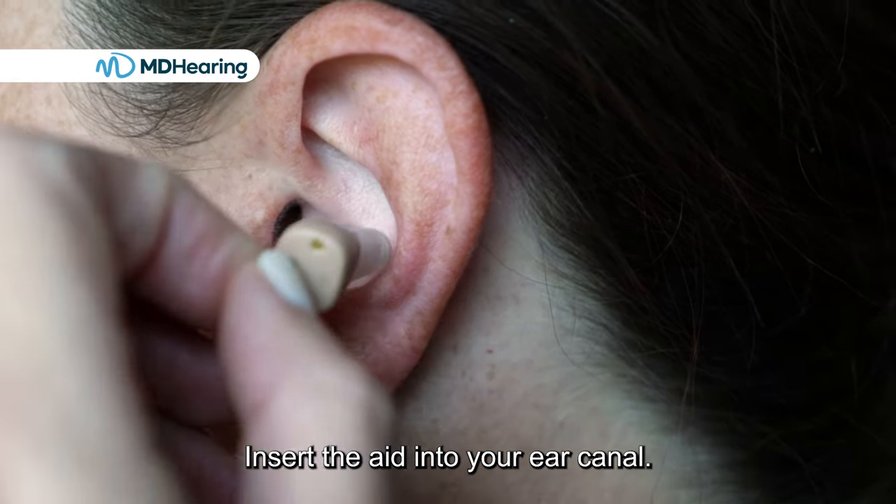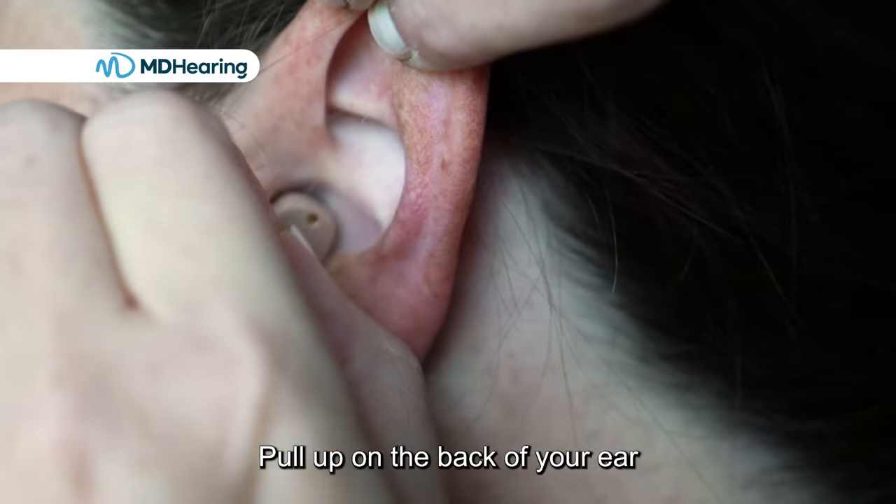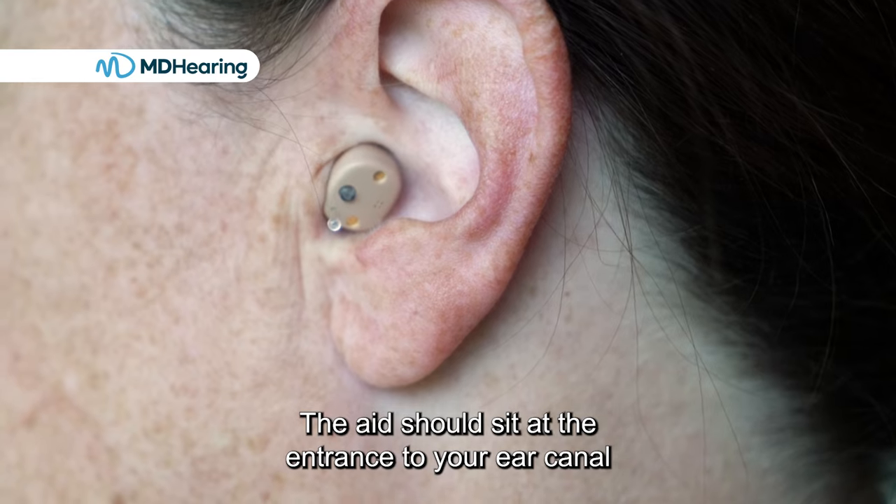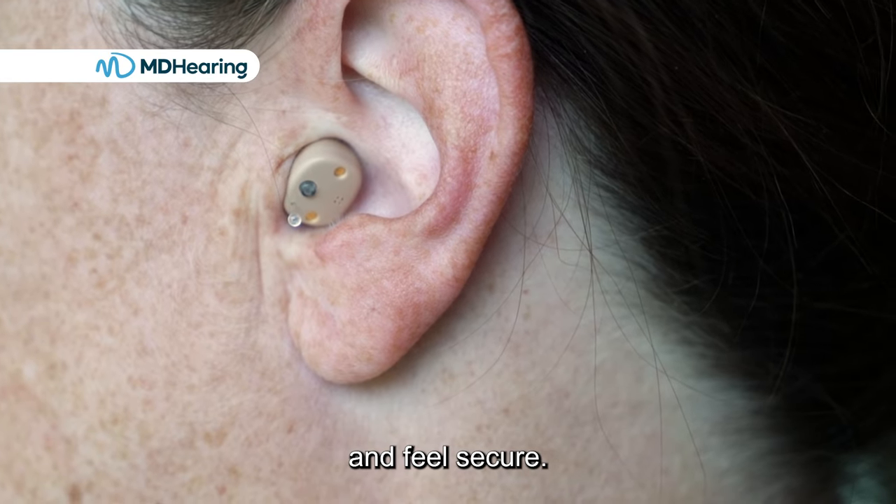Insert the aid into your ear canal. Pull up on the back of your ear to position the aid fully into your ear canal. The aid should sit at the entrance to your ear canal and feel secure.